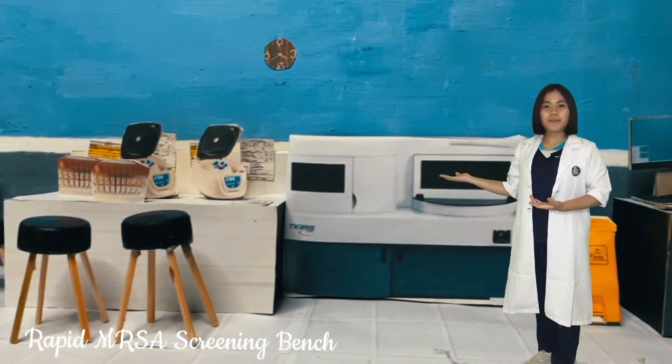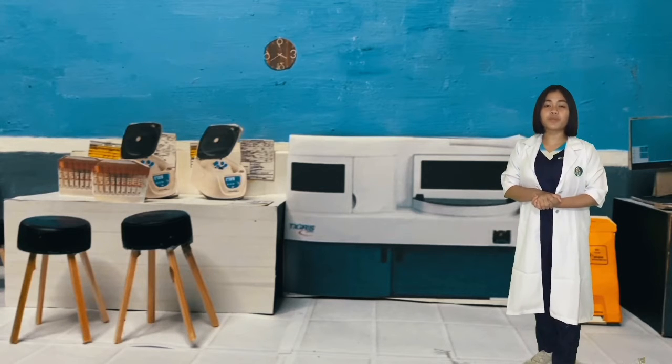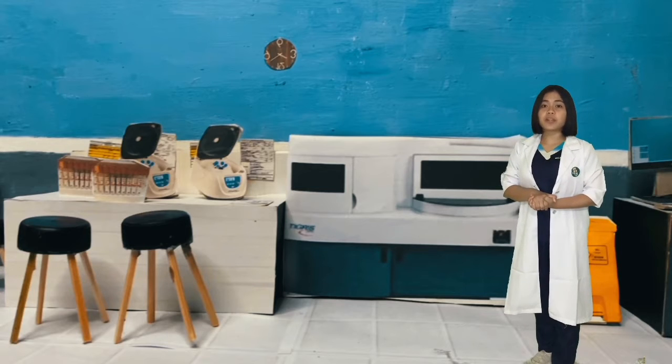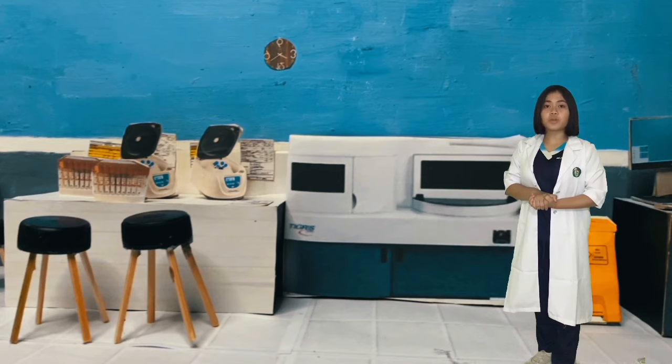This is the rapid MRSA screening bench. It is where patients are swabbed with rayon tip swabs and are screened if they carry MRSA. The detection method used is the PCR method, or polymerase chain reaction method.